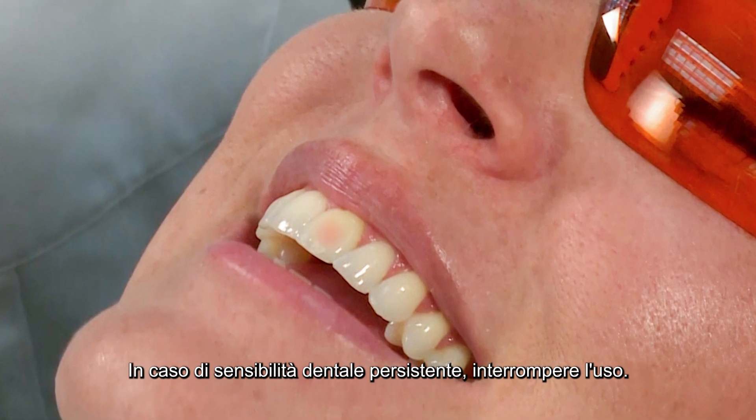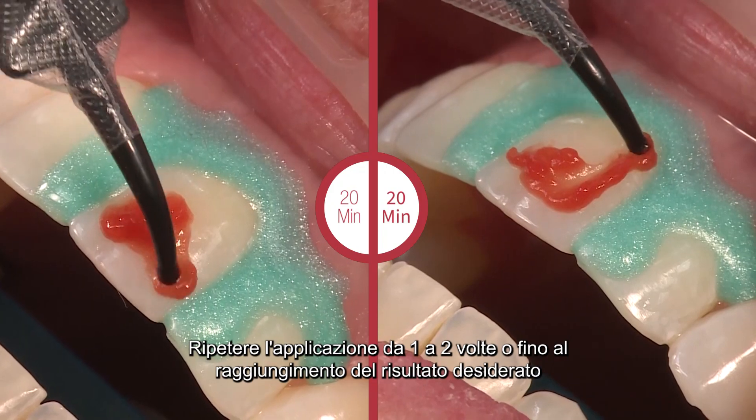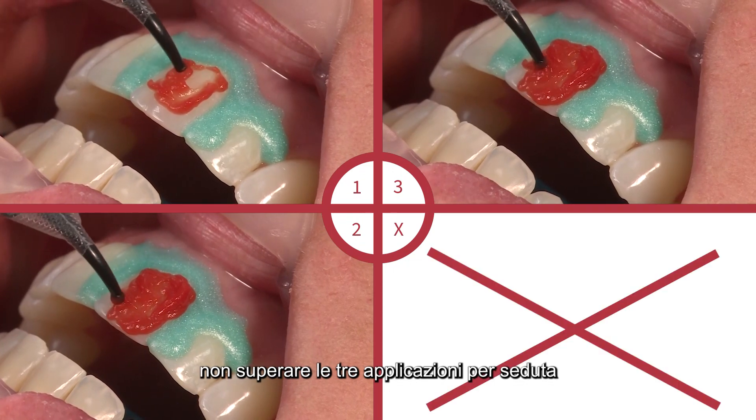If persistent tooth sensitivity occurs, discontinue use. Repeat application one to two times or until the desired results are achieved. We do not recommend exceeding three applications per visit.